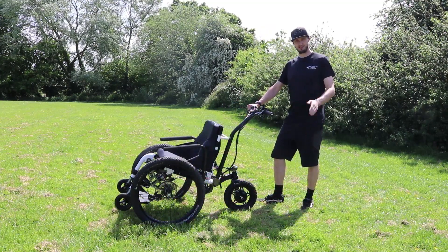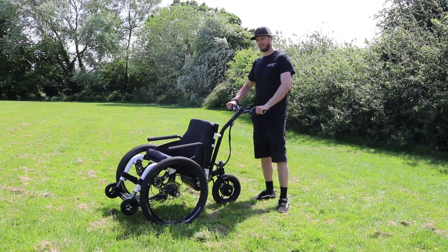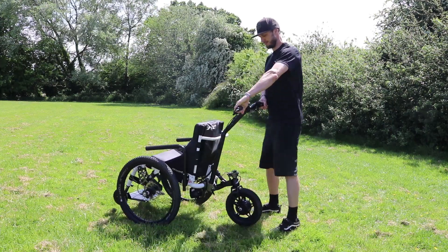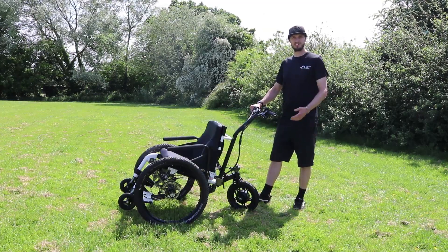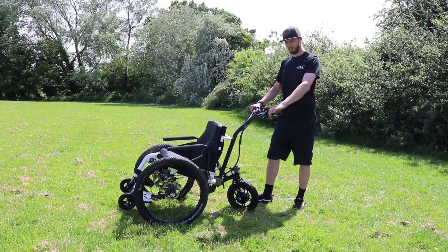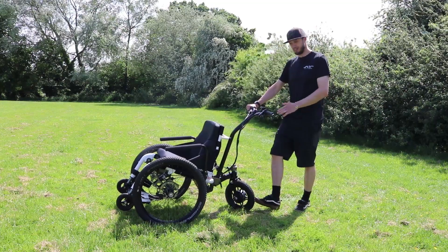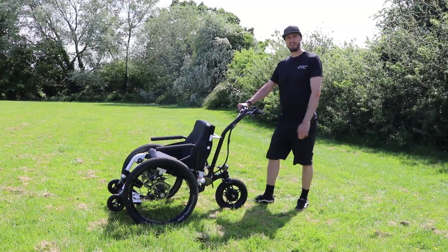You may find in some tight spaces, or to get around particular obstacles, that it's helpful to lift the rear of the trike to reposition it rather than trying to steer around a very tight corner. In which case, you just lift the back of the trike, reposition it and away you go. On some very soft ground, such as sand or deep gravel, you might find that the rear wheel isn't always pointing in the direction that you want. Don't be afraid to just correct it with your foot and straighten it up — that will help get out of situations where it just needs that little helpful push to realign it.